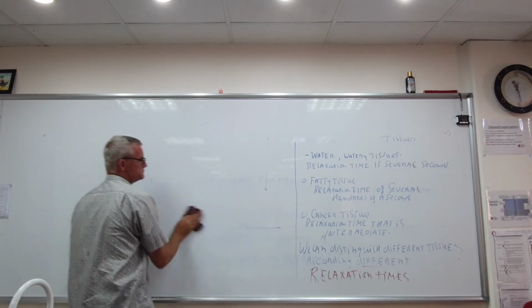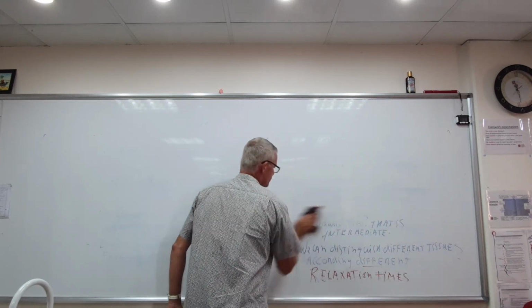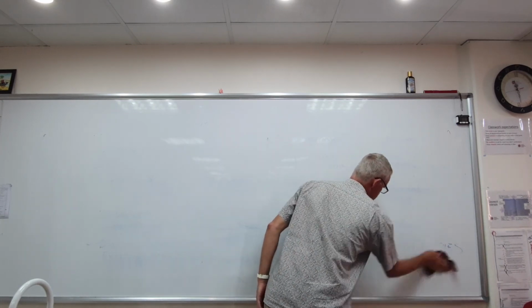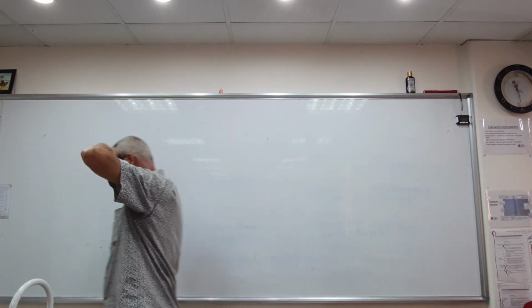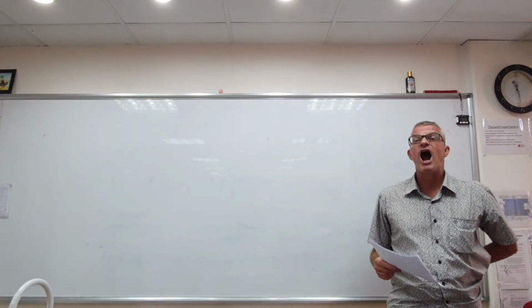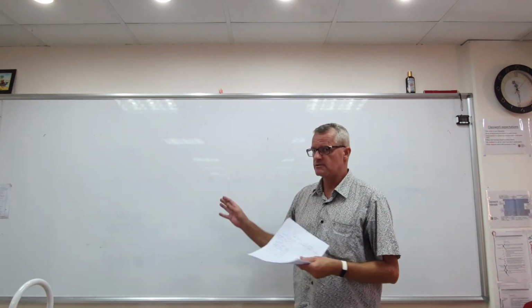So, in review, protons are exposed to radio frequencies. This is the natural frequency of the proton in an external magnetic field. The proton is absorbing this energy. When the radio frequencies are turned off, the proton releases energy in the same radio frequencies, more or less.